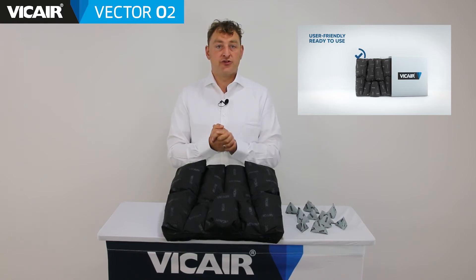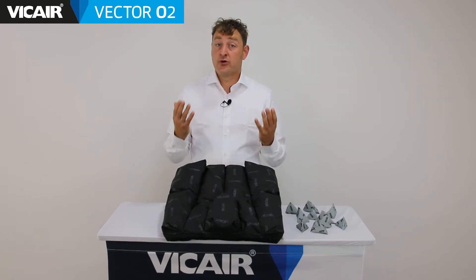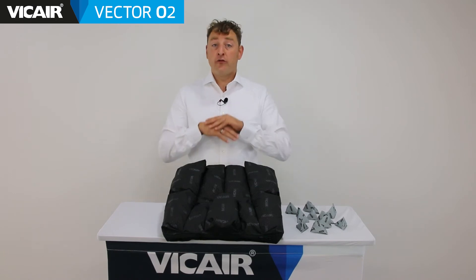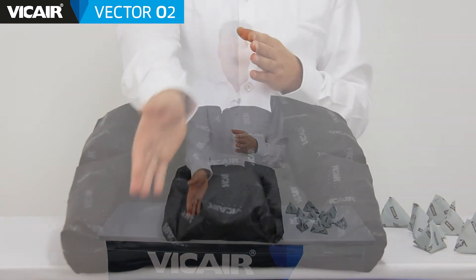The Vcare Vector02 is ready to use out of the box for every wheelchair user, especially for those who need a wheelchair cushion in the prevention or treatment program of a pressure injury, and people who benefit from lateral stability of the pelvis and or need alignment of the femurs.